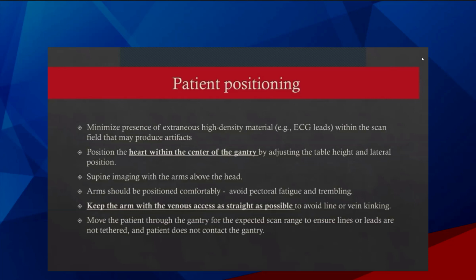You can move the patient through the gantry for the expected scan range to ensure that the lines or leads are not tethered. You want to make sure that nothing's tangled and nothing's pulling. A lot of times, if you're doing a gated scan and you have a nurse there, they have leads as well, or blood pressure cuffs or anything else that a patient may have attached to them. You want to make sure that everything can move back and forth without the potential of pulling or ripping. And you want to make sure the patient doesn't touch the gantry at all.